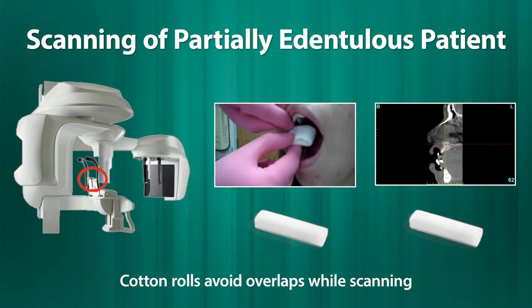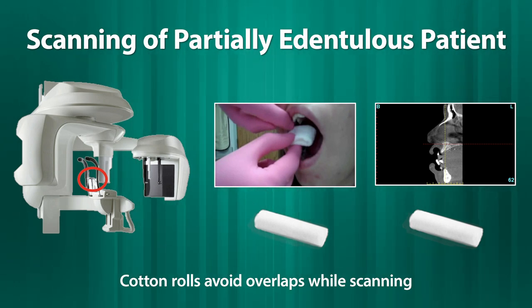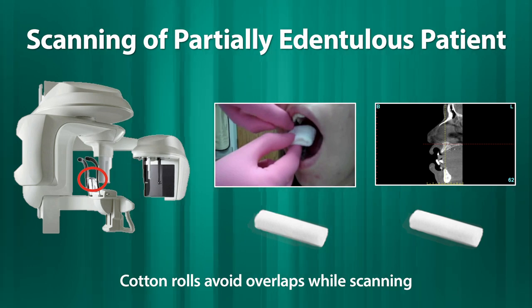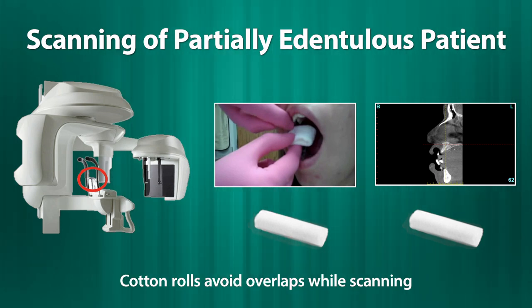Also, it is recommended to place cotton rolls in the buccal vestibules to avoid the overlap of the shadow of the soft tissue on the buccal cortical plate of the edentulous space.